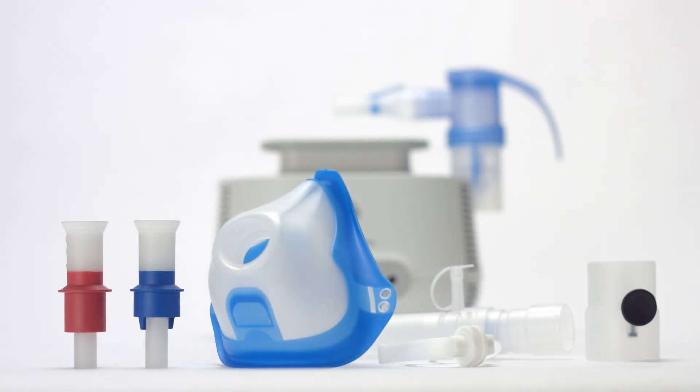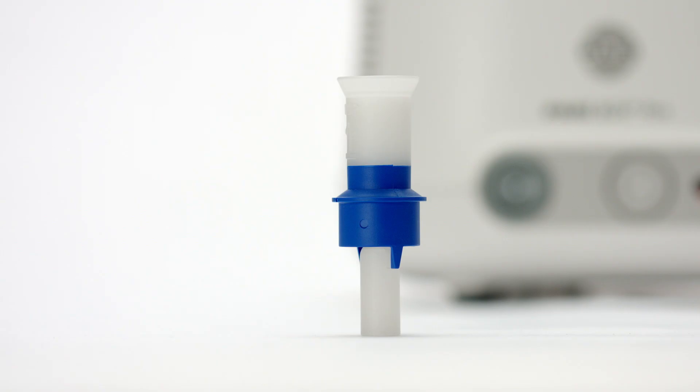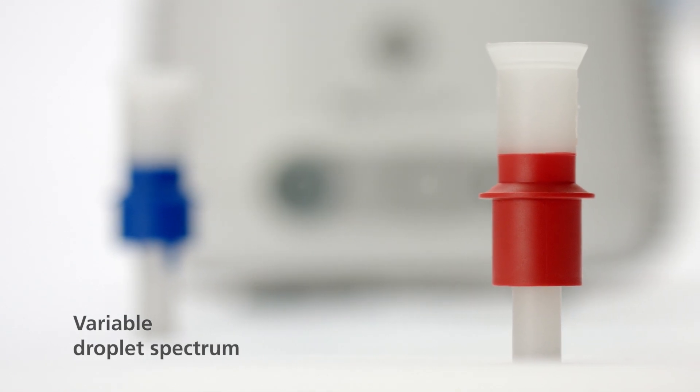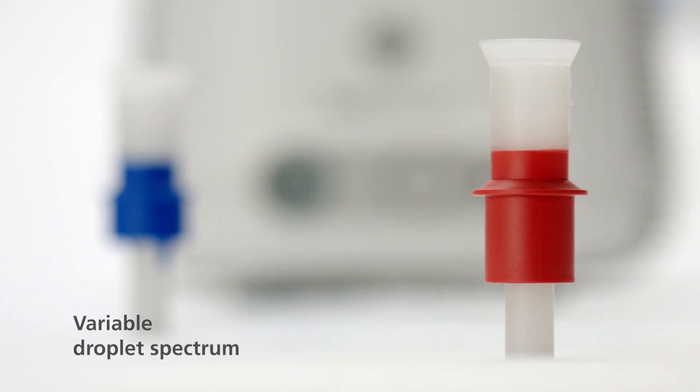Pariboy Pro comes with a range of special features. The blue nozzle insert produces fine aerosol droplets to reach the central regions of the lungs. The red nozzle insert delivers finer droplets, which are needed when airways become severely restricted and which allow the inhaled medication to reach the smallest pulmonary alveoli.